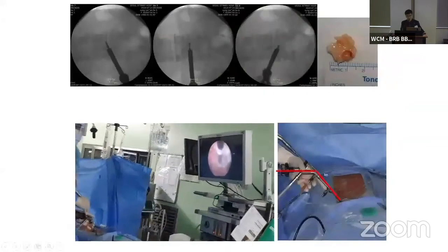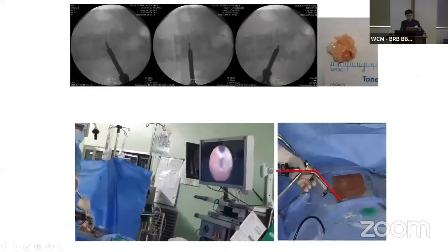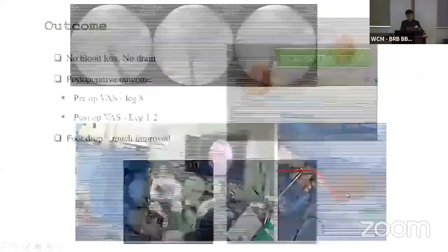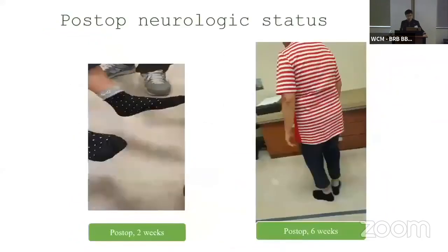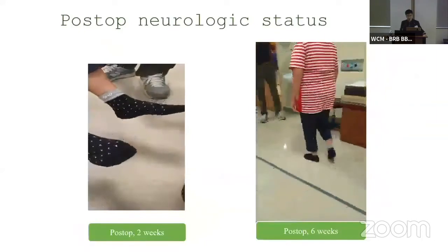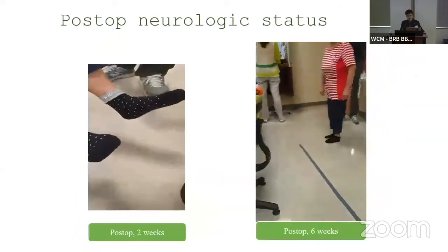You can see the ipsilateral approach angle we made. The result: no blood loss and the outcome was excellent. You can see the patient's foot drop improved and the ambulation was very much improved.